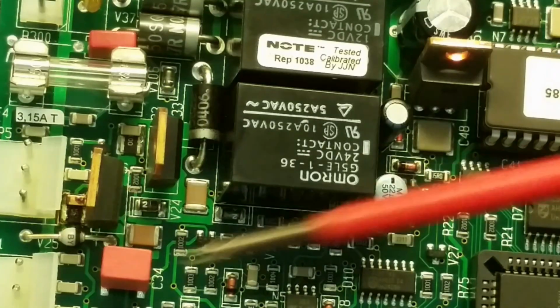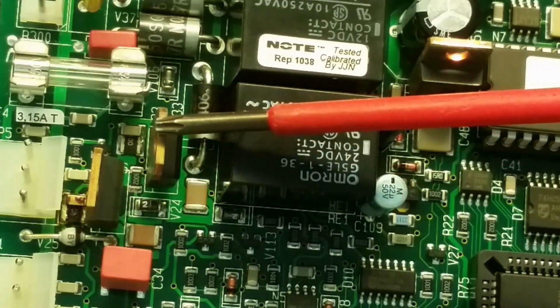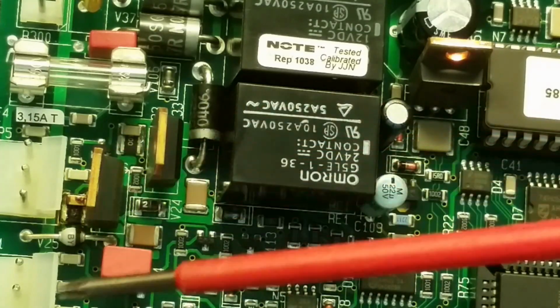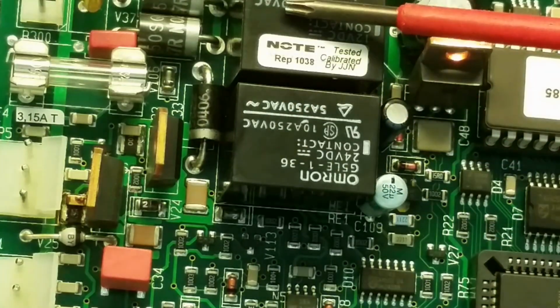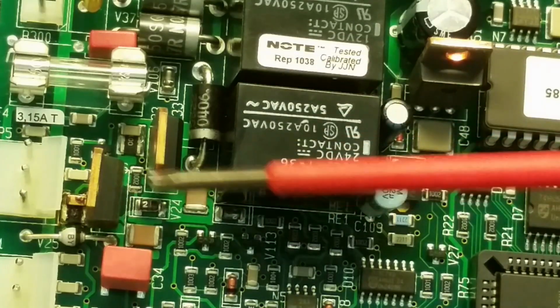And from the top here you can see 2 bipolar transistors that are connected in a Darlington configuration. This is to send a PWM signal to the heater, and that goes through this relay here. The other relay is for switching between battery or mains operation.